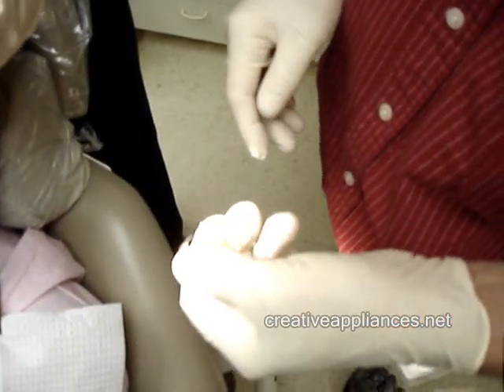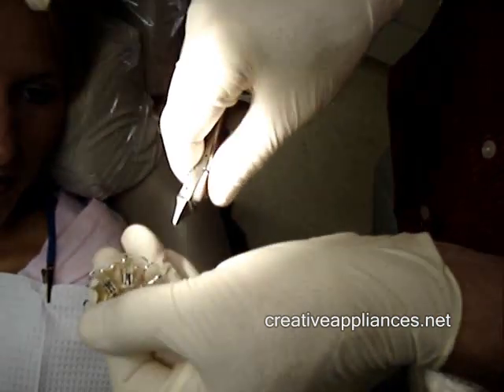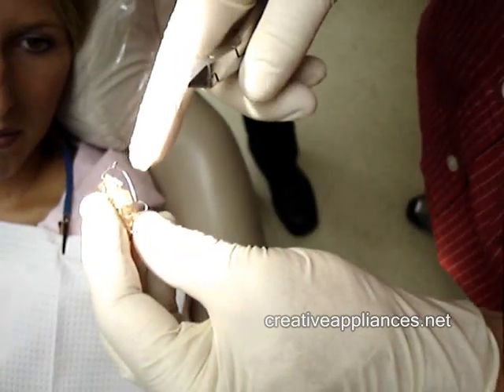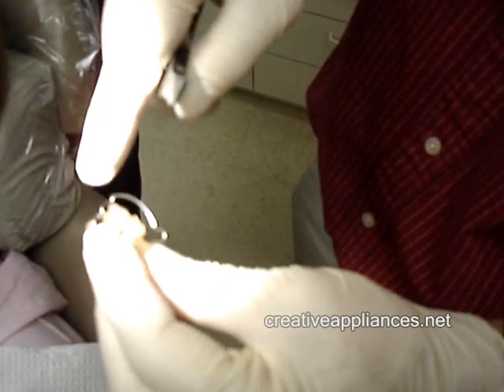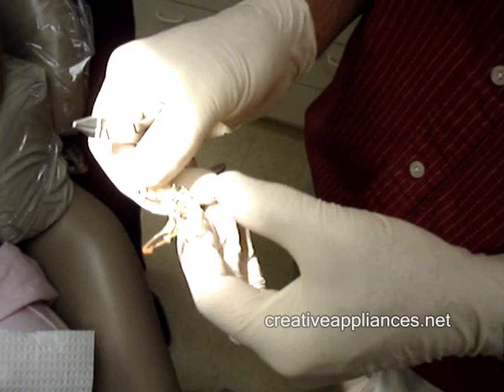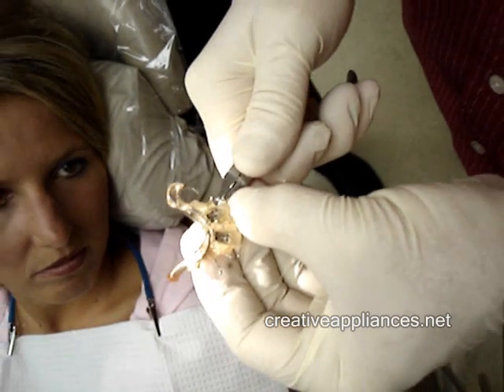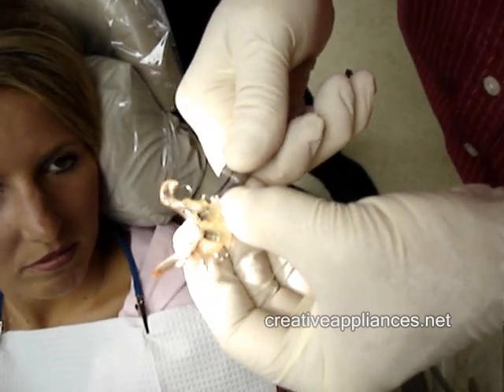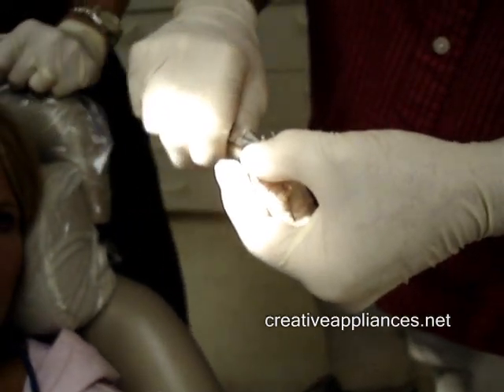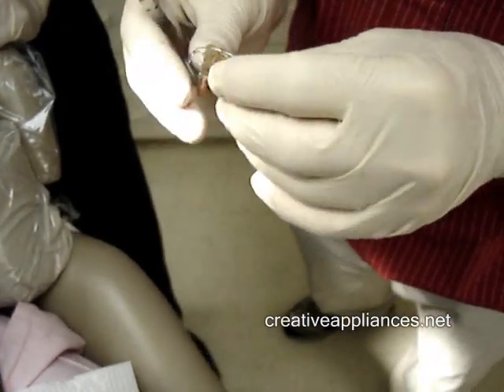I'm using the round side against the round side of the curvature, for the outside of it. Now, what that just did — if we were to put it in her mouth now, rather than being in the center of her teeth, it's going to drop down towards the gingival. So in order to counteract that, I'm going to go up where this bend is and bend that way just a little bit. That rotation is clockwise — just that slight rotation on both sides — and now that should bring everything back up.